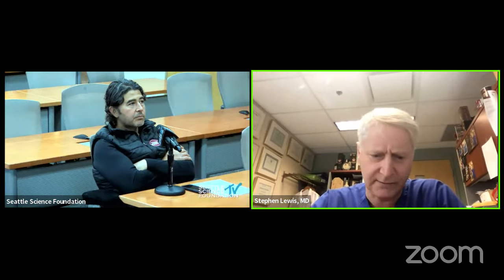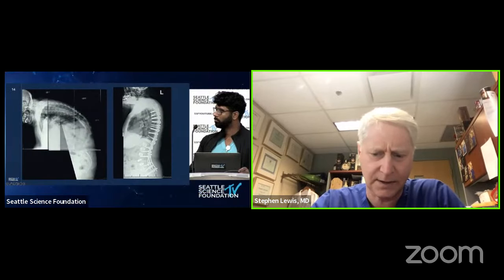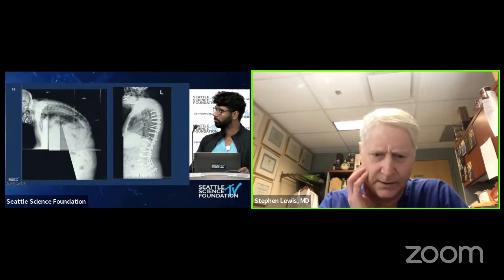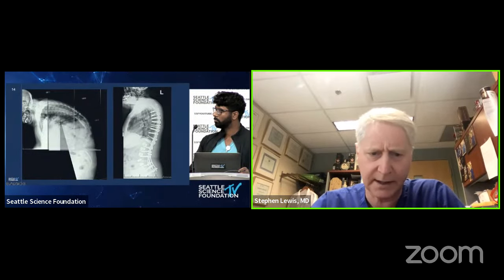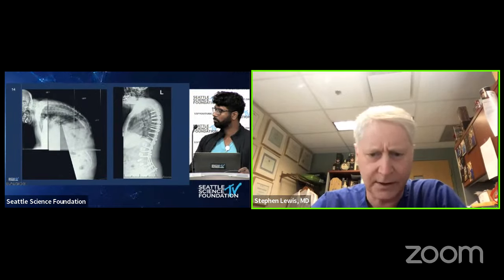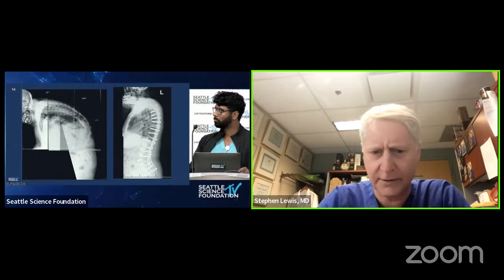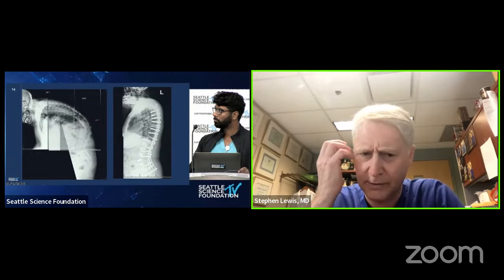Usually we don't have a lot of money for BMP on our cases, but that would be one I would consider at the high-risk areas, which for me are at the top and the bottom of the fusion. And I would use an extra rod in the lumbar spine. Usually I do it through dual-headed screws, because I don't like to use the connectors, which usually sit over the facet joints. I'll just pass a second rod through those screws. So I do a similar construct, all posterior though.